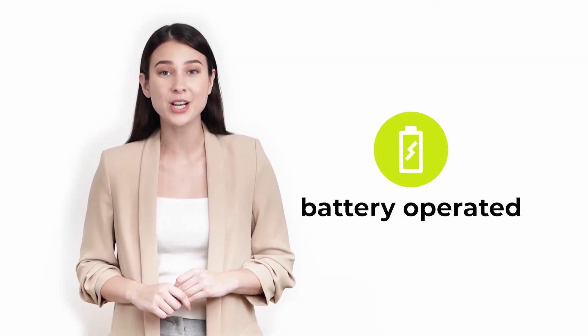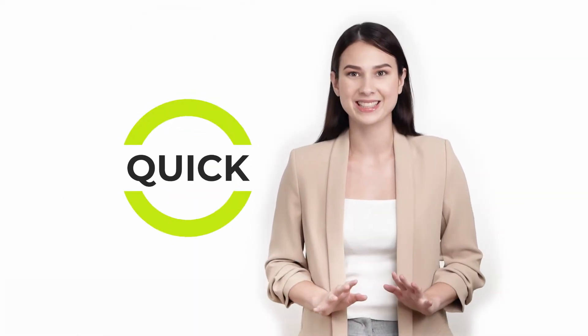1. Portable — Curo L7 is battery operated so you can always use it on the go. 2. Quick — get fast results in three minutes. Small enough to be held with one hand and easily fits in your pouch or bag.